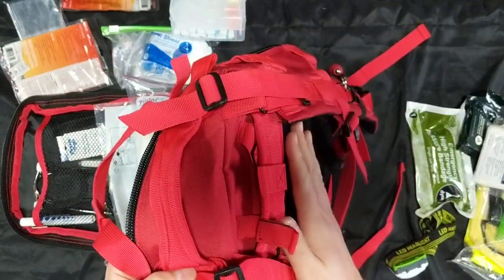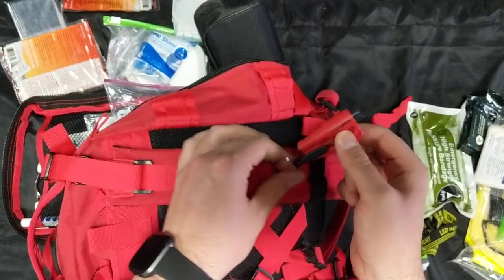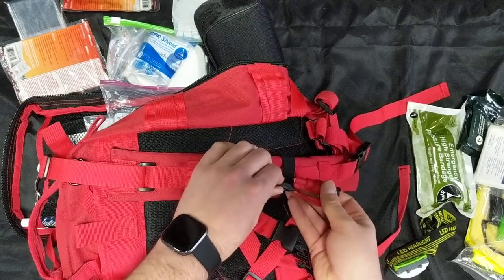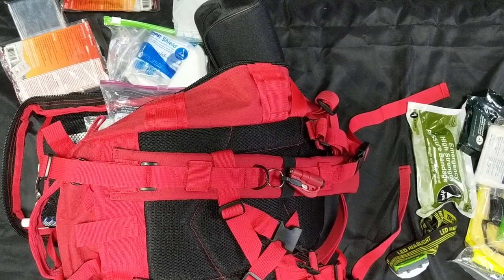On the front of the bag there are really awesome padded shoulder straps with nice airy padding on the back. You also have a car rescue tool that just pops off, with a window punch and a seat belt cutter built in. That is the First Responder Jump Bag, now available at wildmedkits.ca.